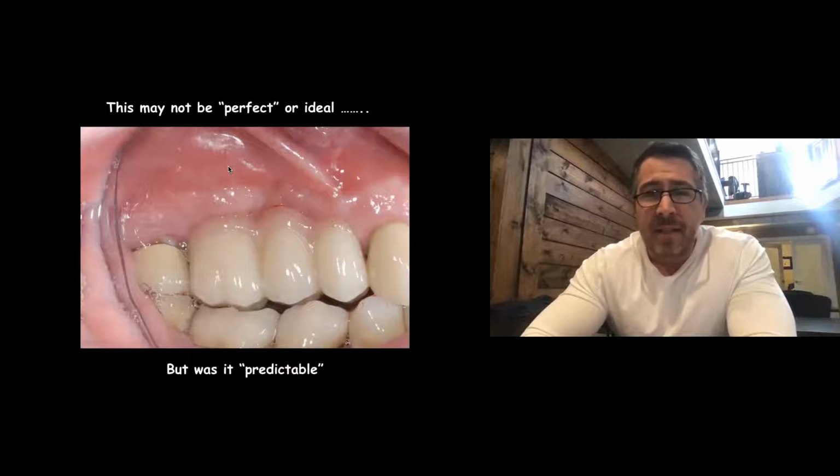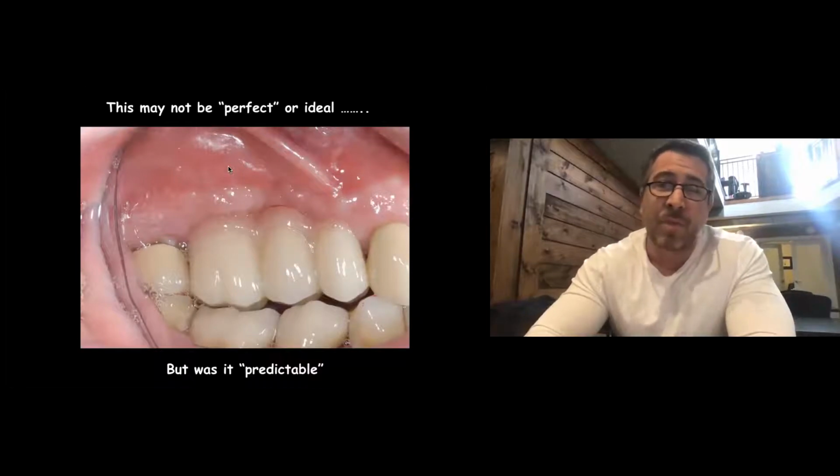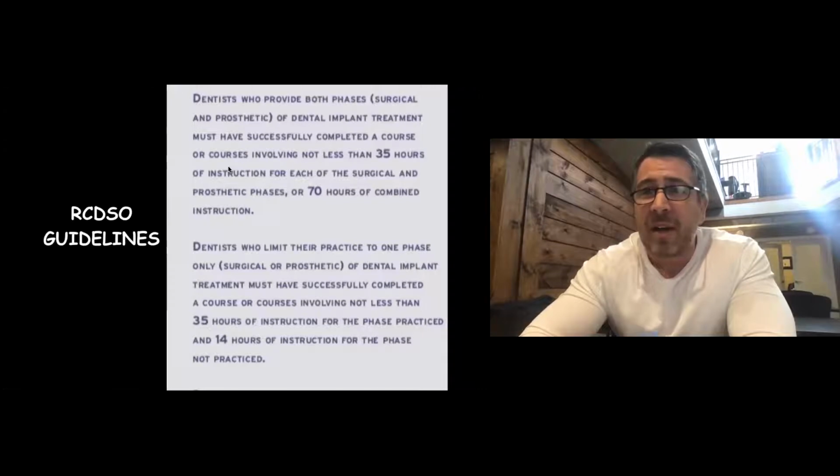So when we look at a case like this, it may not be perfect, but was it predictable that I would be incorporating pink porcelain into this case prior to even starting? So should we be able to understand that this is what the case will look like before we even start talking about implant dentistry and grafting and how many implants and where do they go? What is the case going to look like before we start? So again, predictable. How do we incorporate this plan that Azim laid out for us, but with a predictable outcome? And this is exactly why the college has outlined the fact that we, as implant dentists, need to have both surgical and restorative training. You can't just have one or the other because they're so dependent upon each other.